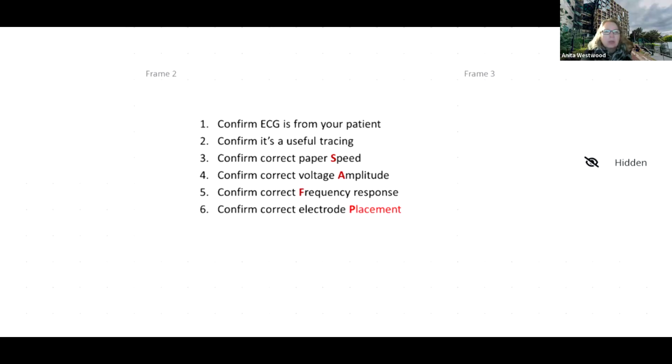I just think that we're in an unprotected environment, so we need a narrower bandwidth than what's usually used in a hospital, because they generally have protection from electromagnetic force that can interfere with the reading. So that's why we have a narrow width generally in the pre-hospital environment.